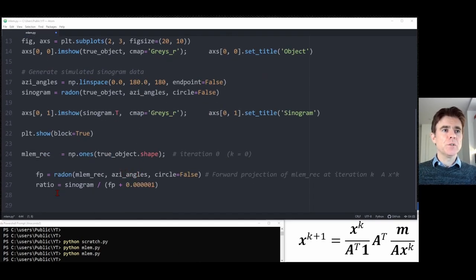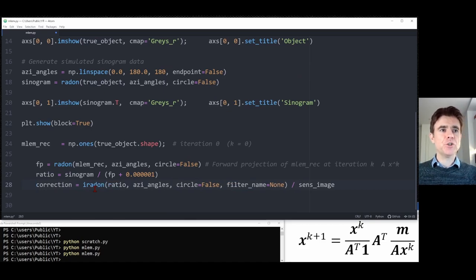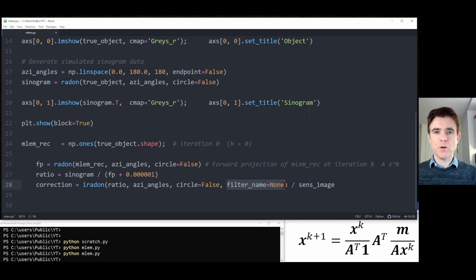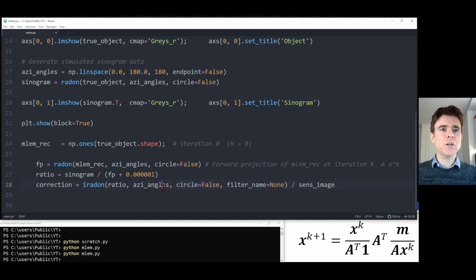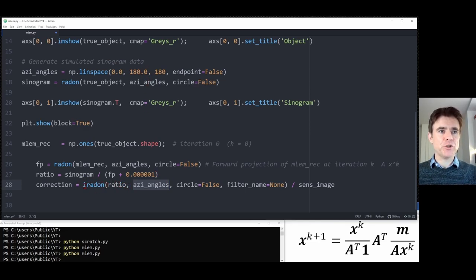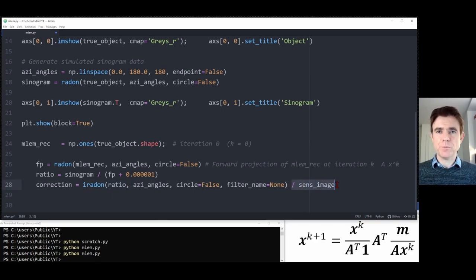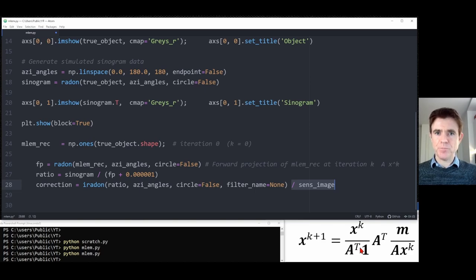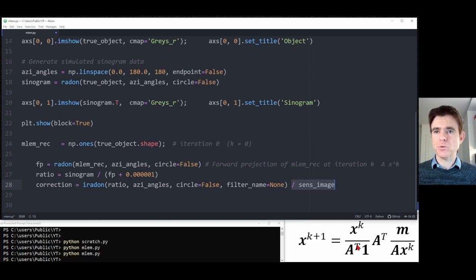We create a correction image using iradon with no filter — that means it does the transpose of A rather than the inverse (the inverse would be used in filtered back projection). We're doing this for the entire square image, over those azimuthal viewing angles, applying the back projection to the ratio sinogram. In the formula, there's also a division by something called the sensitivity image — that's A-transpose applied to a vector of ones — a measure of how many back-projected lines impact each pixel in the reconstructed image x^k.